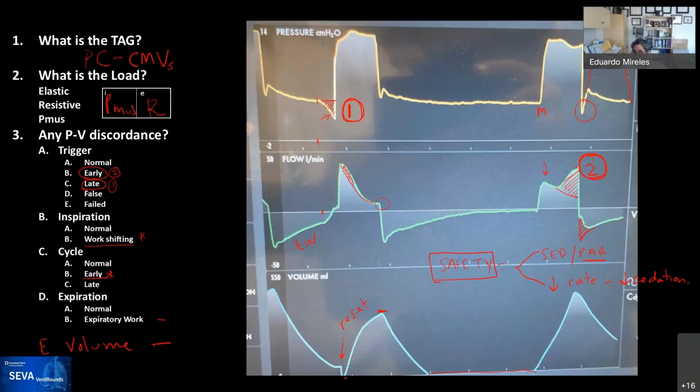But this also highlights why this is such an evolving field: what's the mechanism for somebody that has what we call reverse triggering and is brain dead, and how does that actually work? So we need to learn. I mean, the first animal model was published this year, and so that will help us understand a little better how this type of desynchrony works.